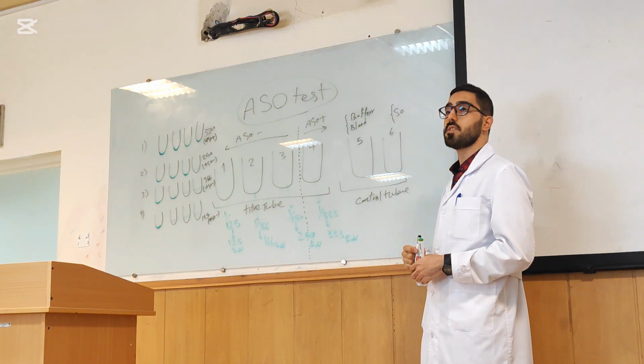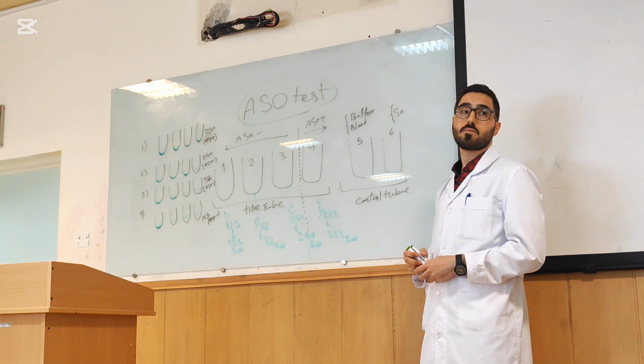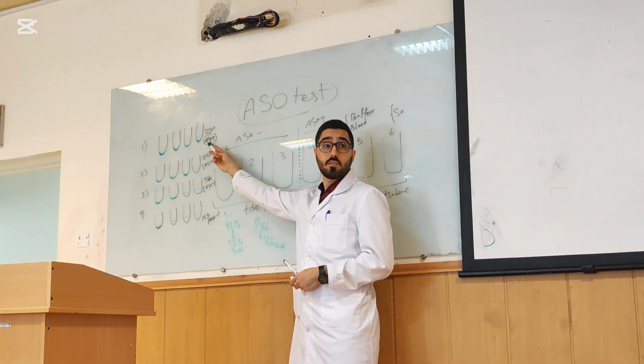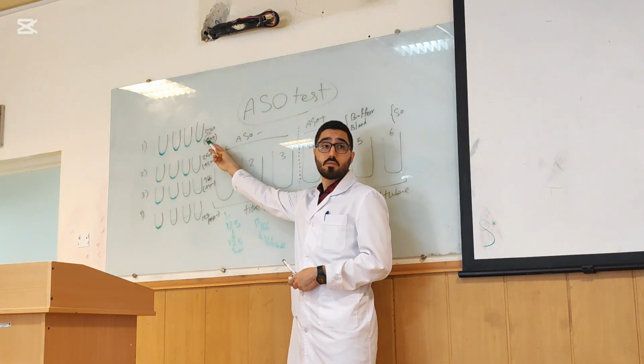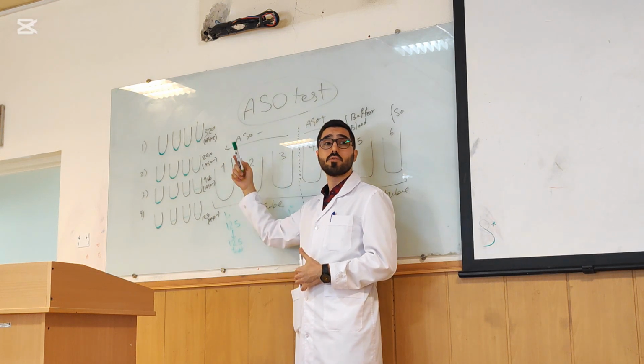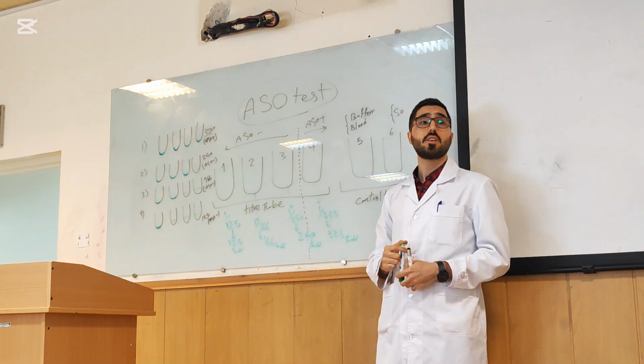Okay, any question? Doctor, why in the first case do we say positive? Is the patient negative, does he not have fever? Yes, he doesn't have fever, and we have no lysis in the four tubes. So why do we call it ASO positive? It means the patient is unhealthy. No lysis, it's not good.